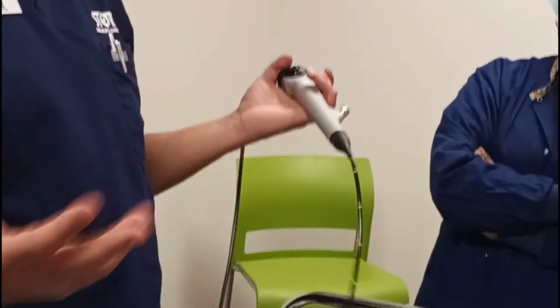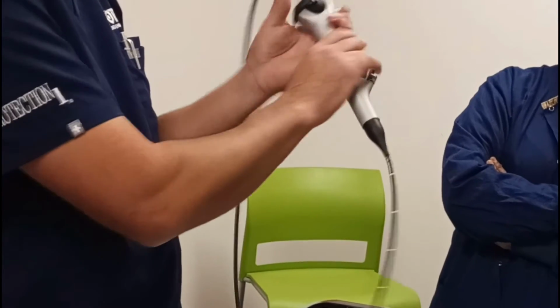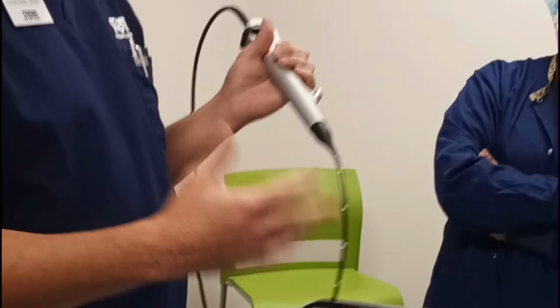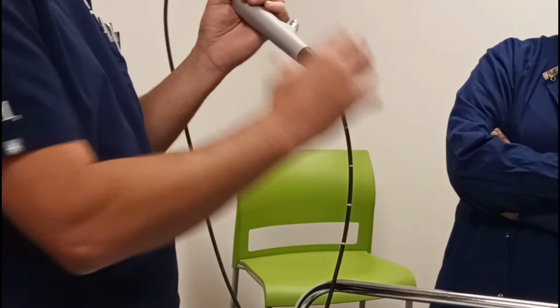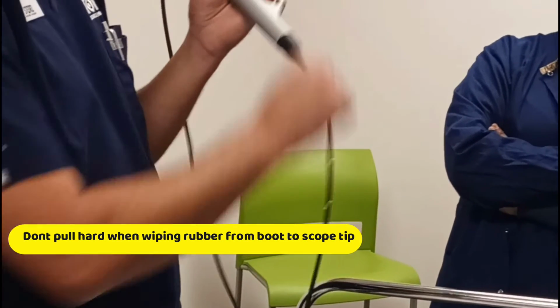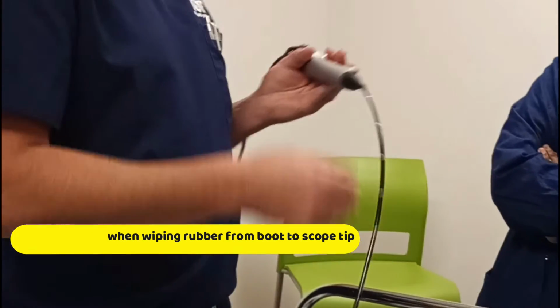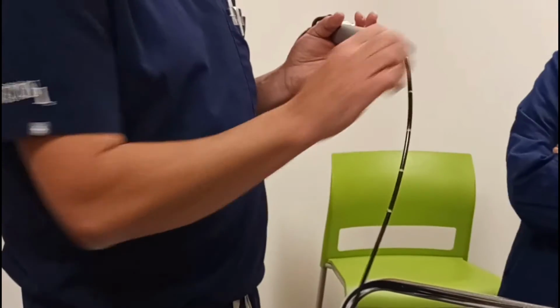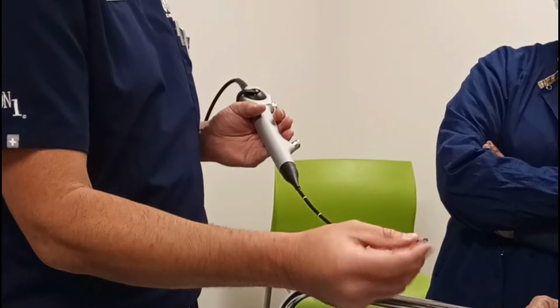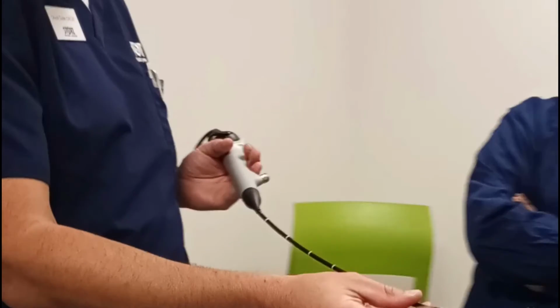For lint-free cloth, we're going to dab the exterior of the scope. We're going to wipe it down, and when you get to the shaft of the scope, this is very important to take note of. You don't want to grab your lint-free cloth really tightly and pull. You want to avoid pulling down on the scope, and the reason is this is rubber. Over time, if you're grabbing it and pulling it, it's going to stretch the rubber of the scope, and eventually the rubber is going to extend over top of the distal tip of the scope, and it's going to cause an overlap.